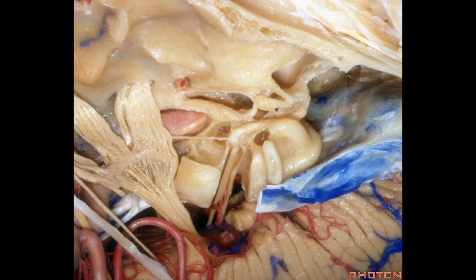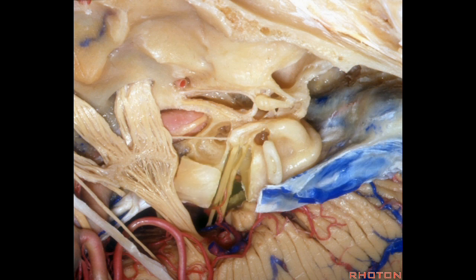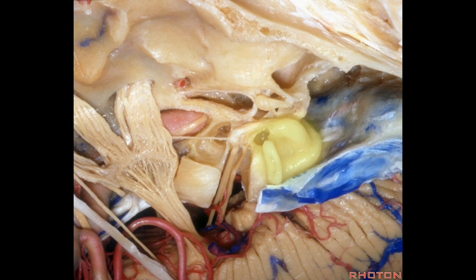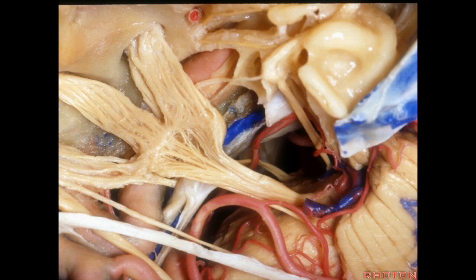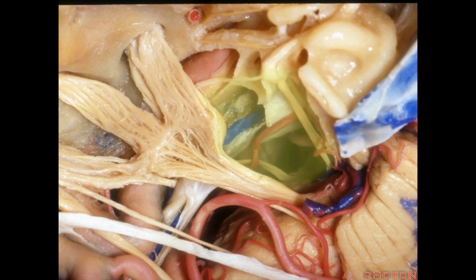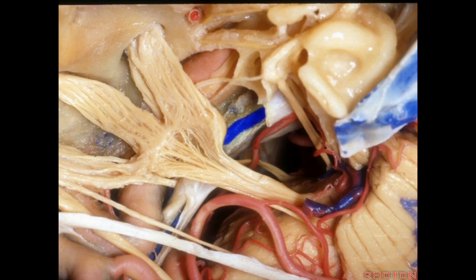We can drill three approaches: one through the petrous apex, one to the internal acoustic meatus, and the other to drill out the labyrinth and do an extended middle fossa approach. Here we've now drilled out medial to the meatus, the anterior petrosectomy approach, down to the clivus and the inferior petrosal sinus.